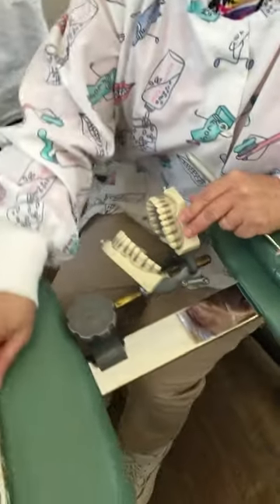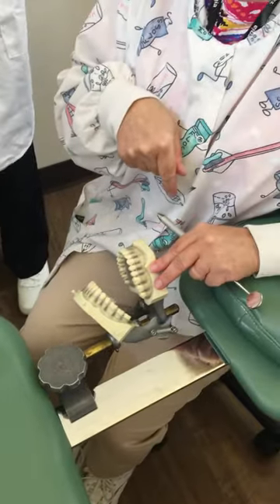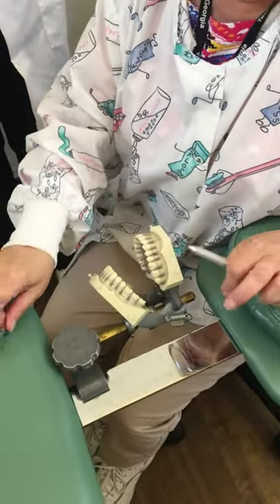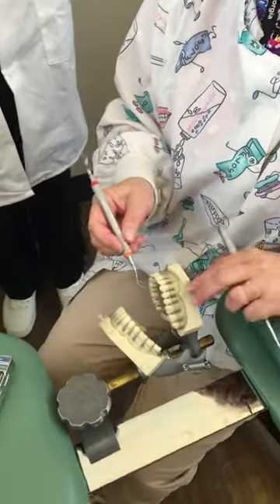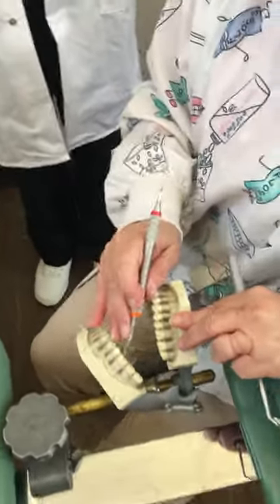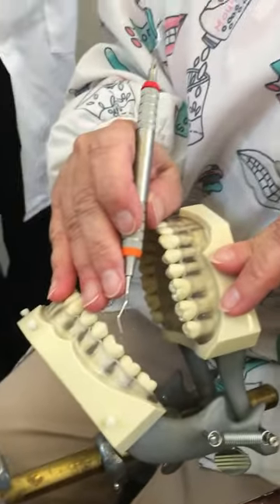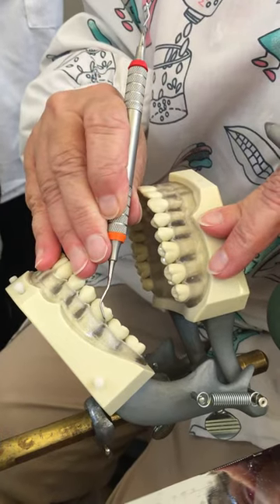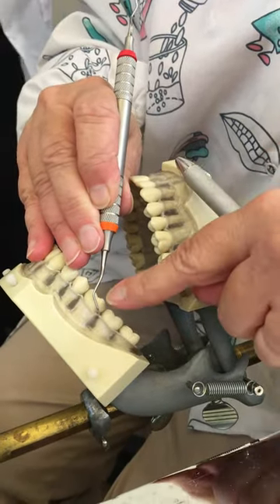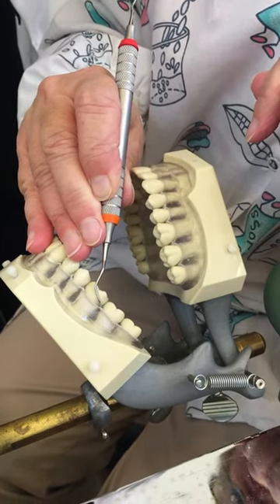I'm going to turn my mannequin toward me. I've moved up to the 11:30 position and I'm going to start with the Gracey 13/14. We have to check for the correct end again. So I'm going to come through the arch and place it on the distal, and I'm going to look for the lower third of the shank to be parallel with the long axis of the tooth.